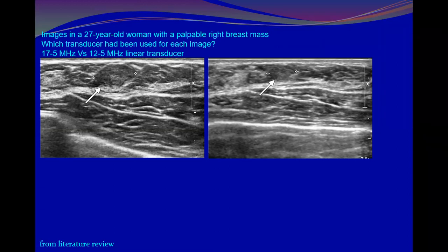By applying pads. Applying pads to see more superficially. A pad of gel, yes, about 1 centimeter or so.